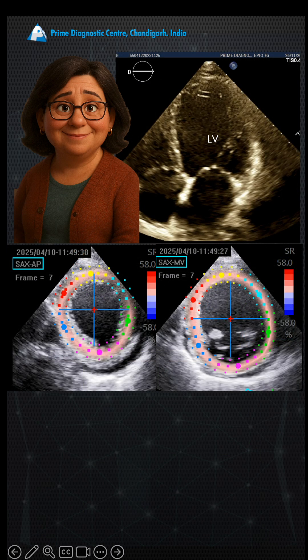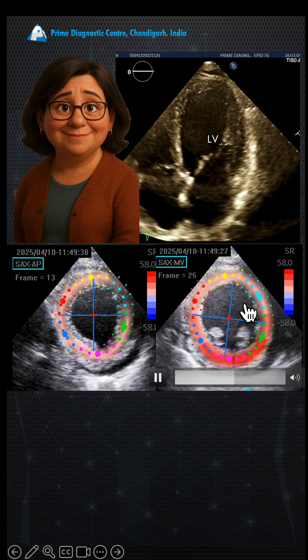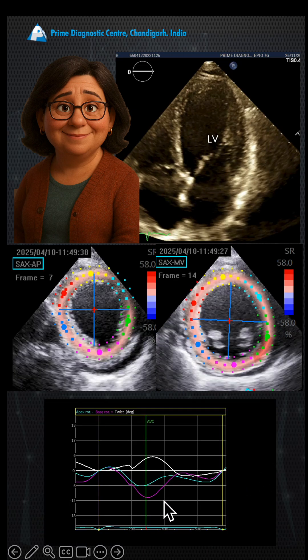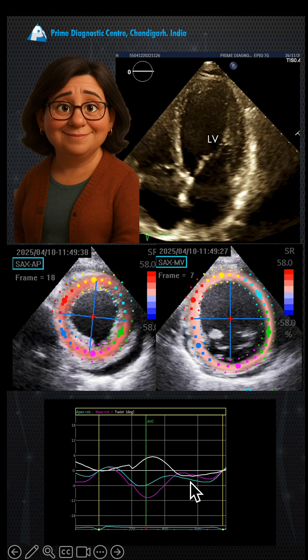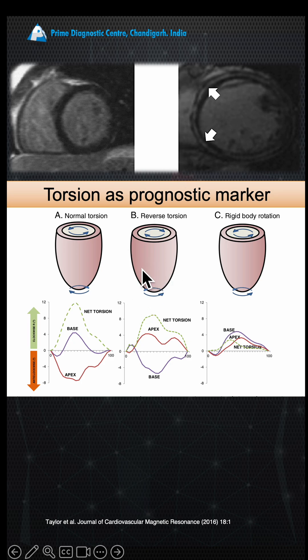But in this patient, the longitudinal and circumferential strain of both the apex and base move in the same direction, so there is a loss of squeeze. This happens generally because of fibrosis. Fibrosis at the mid-level of the LV prevents the squeeze from occurring. We call this a rigid body rotation — where both apex and base move in the same direction, as in our patient.